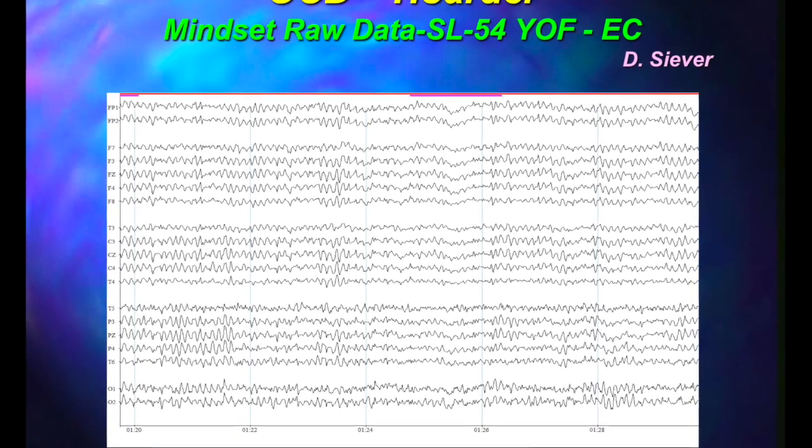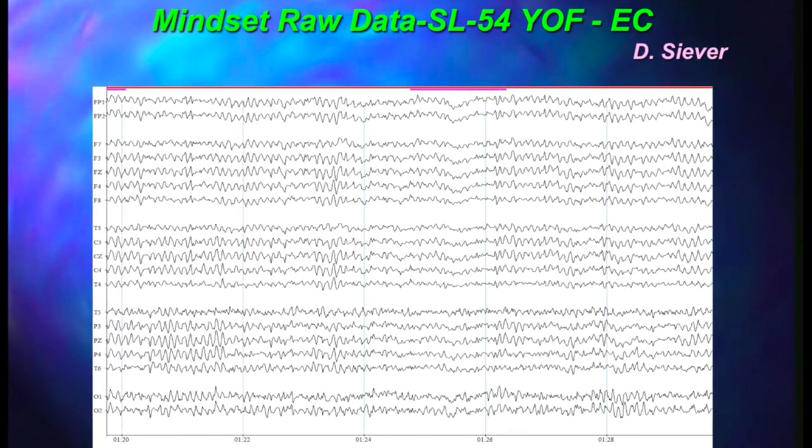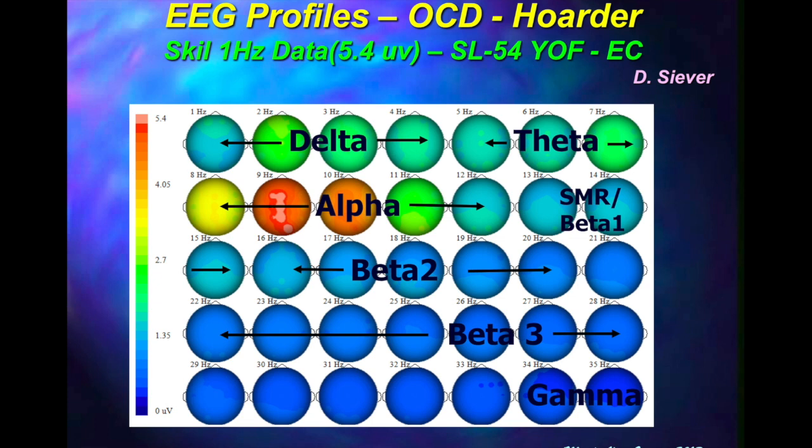Her networks are intact because we see the thalamocortical loop is working, because we see these alpha waves present in the record. Now, when we take a look at it though, you'll see at 9 hertz, the dominant activity in an eyes closed condition is down the middle and down the cingulate. The back one, near the back, is also a little precuneus and a little bit of the occipital on the right-hand side. But a lot of it is also affecting more frontal, down the center, and that's the cingulate and probably the caudate. And it's also slowed at 9 hertz. And that's another sign of OCD. Typically, it's slowed as well.